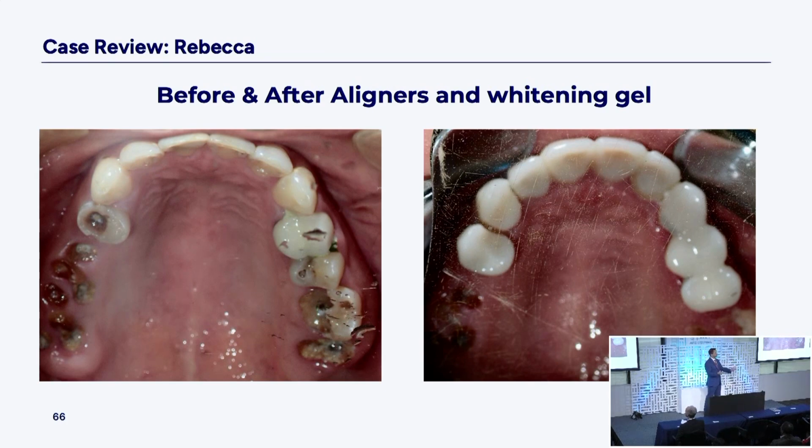Now here's one quick little tip with you've got temps on here, right? I'm about to go through a good 10 months of the aligners. When I put temporaries in to go into clear aligners, I use permanent cement. I like permanent cement in there, not because I don't want them coming out to re-cement them. You are worried about washout and them not coming loose. So if your temporary cement leaks, then by the time 10 months goes by and you take them off, you've got a new round of decay in there. So permanent cement in your temps, don't worry about it. You can then handle your case afterwards. They might come off for you, they might not, so you cut them off, you make a new set. Don't worry about it, that's easy.